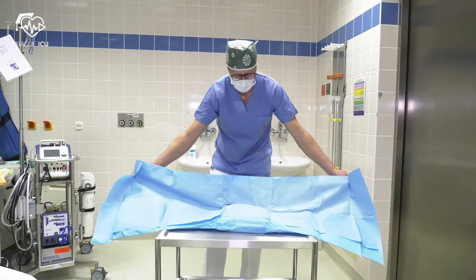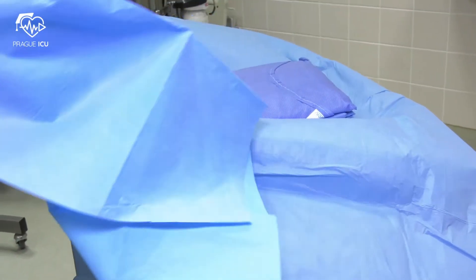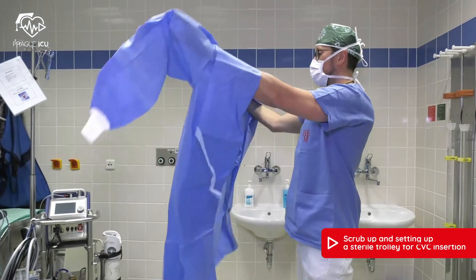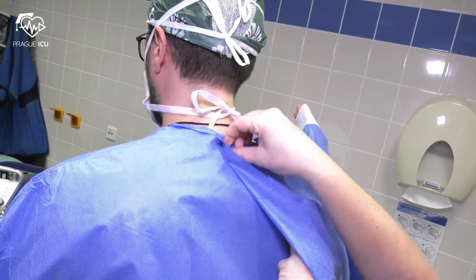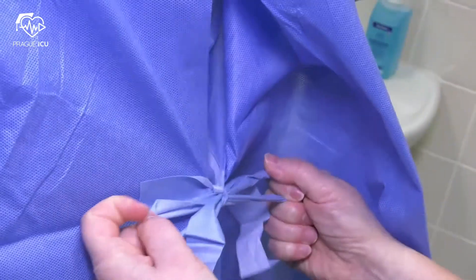Never reach over your sterile field. Pick up the entire folded gown by grasping the gown through all layers and carefully insert your arms into the gown. Make sure the gown doesn't touch any surrounding unsterile objects. Your assistant will secure the gown at the neck and fasten the gown behind you.